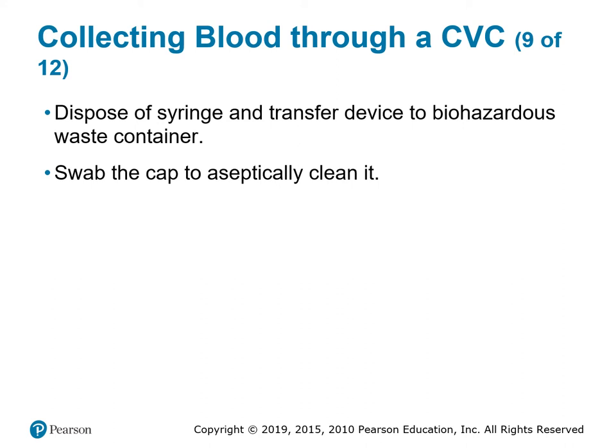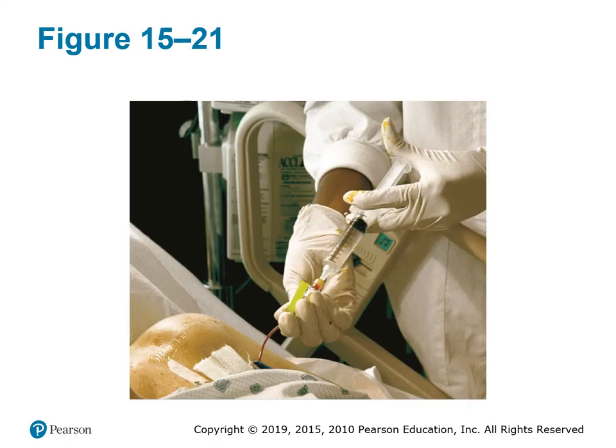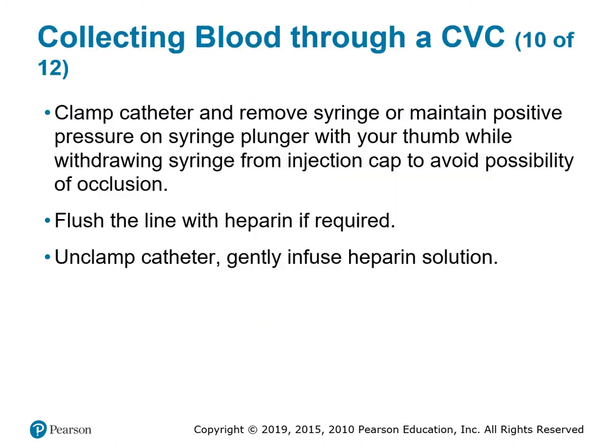Like when you go to cap the needle off, you wouldn't put your whole hand over the cap or needle and pull it off like you may do a pen cap. No, hold the needle with thumb and index finger and remove the top aseptically, with as minimal contamination as possible. Then there's flushing the line again, getting ready to clean that blood out of there so that it doesn't become contaminated and lead to the patient getting sick.